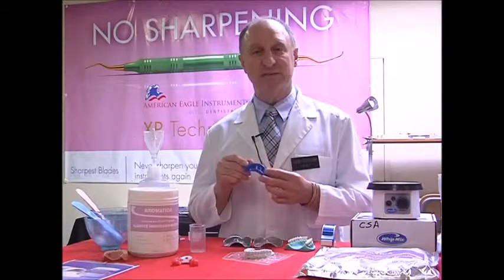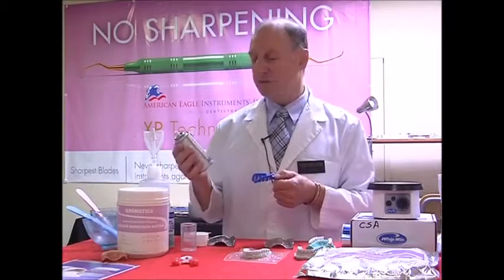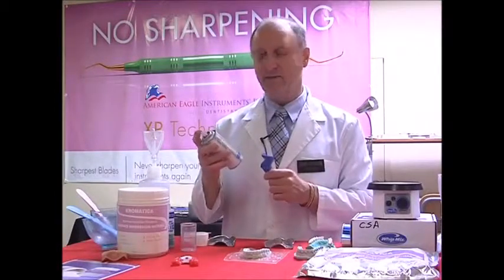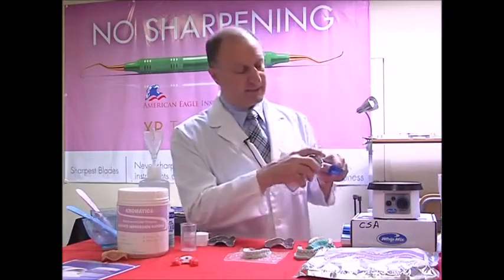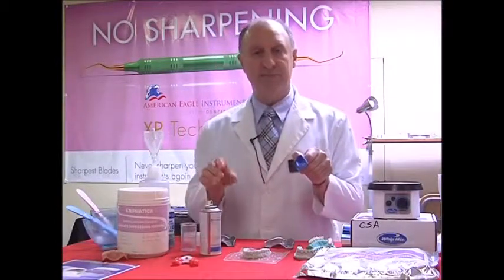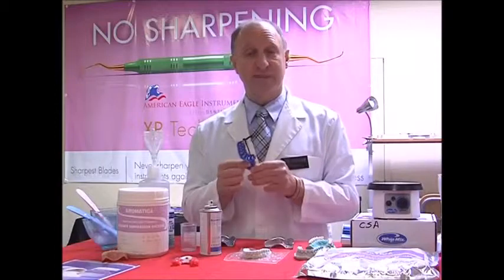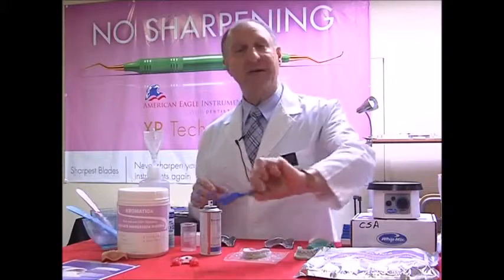So we should be using a good adhesive inside. In order to do that, I'm using a vegetable-based adhesive called TAC, T-A-C, Tray Adhesive Compound, from a company called Bosworth. It does actually come with two of these little depressors, and it's nice and easy to use. So I'll just make sure that it's simply adhered. By spraying this lightly onto the surface, I then wait 1 minute, and then I can apply my impression material down inside. And no matter how hard I try afterwards, it will not separate from the tray. It stays within. So it means the trays have to be thrown away afterwards since we can't clean out the material. So that's looking at the impression trays.